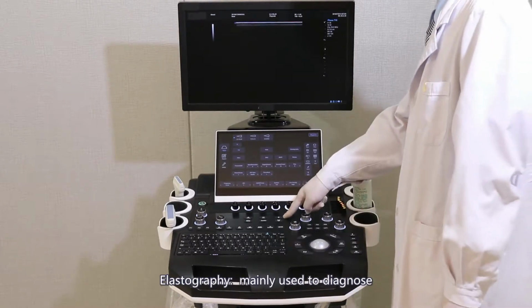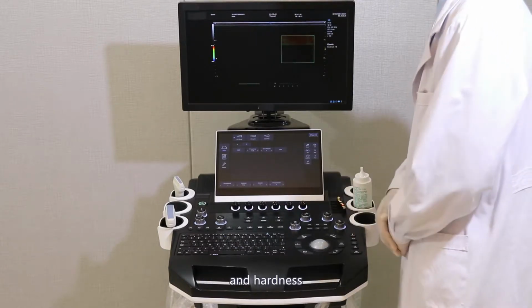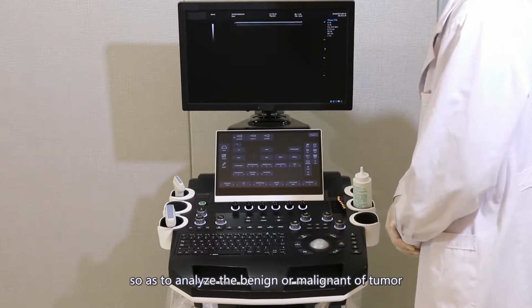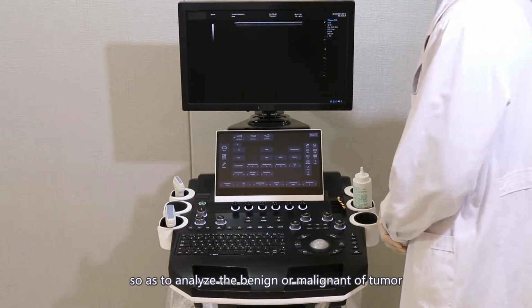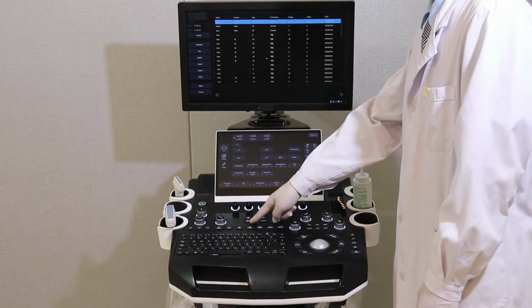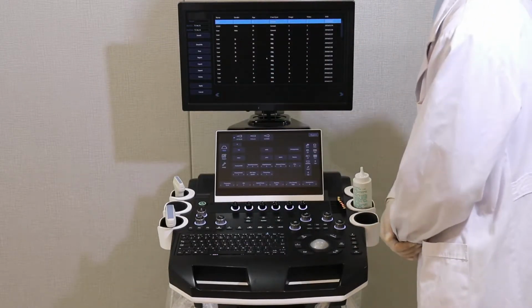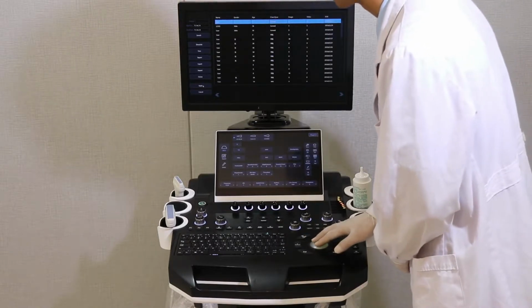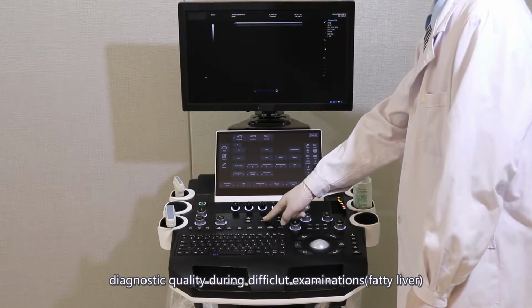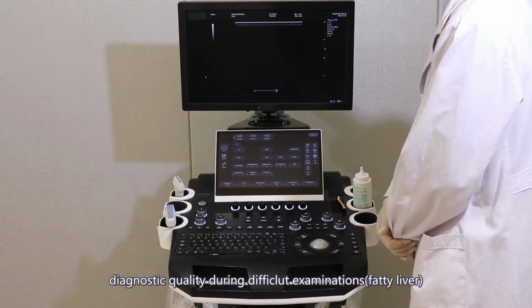Elastography. Mainly used to diagnose the degree of softness and hardness of a tumor, so as to analyze whether the tumor is benign or malignant. iWork. To call out patient information and store image information. Spatial composite. Improve diagnostic quality during difficult examinations, for example, fatty liver.